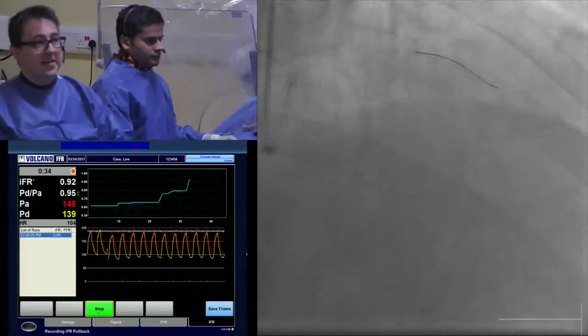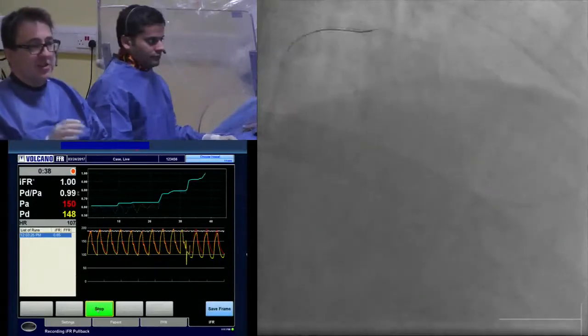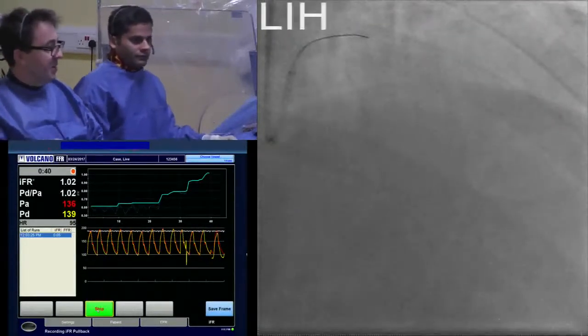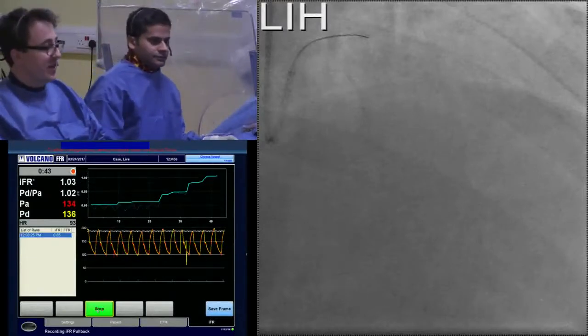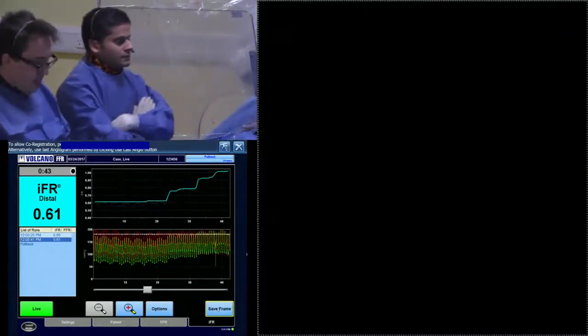So what you can see is you're coming back again in this nice blue line, which is the solid blue line trend line. And underneath that you have the dotted line, which is actually the raw line. It looks like there's a couple of nice step-ups here. If we stop the recording there — which is very nice.